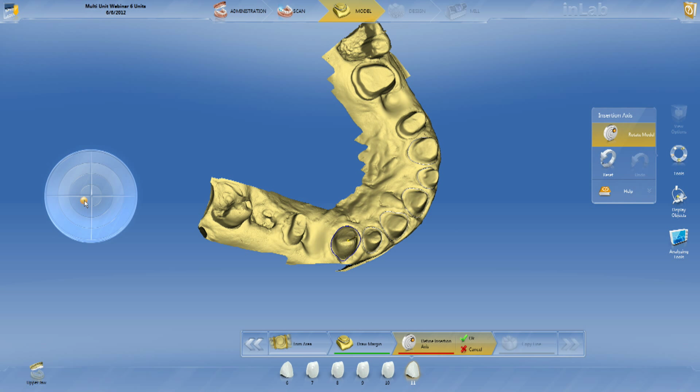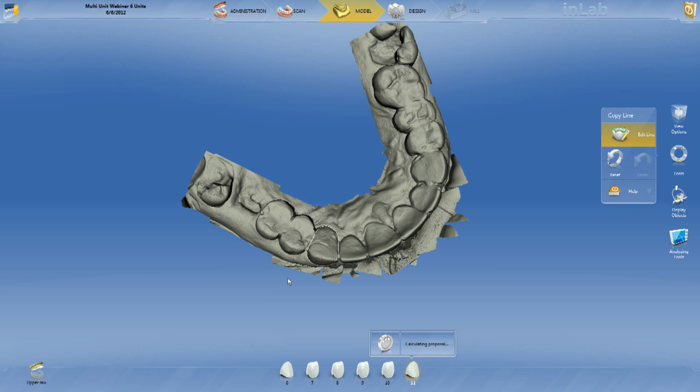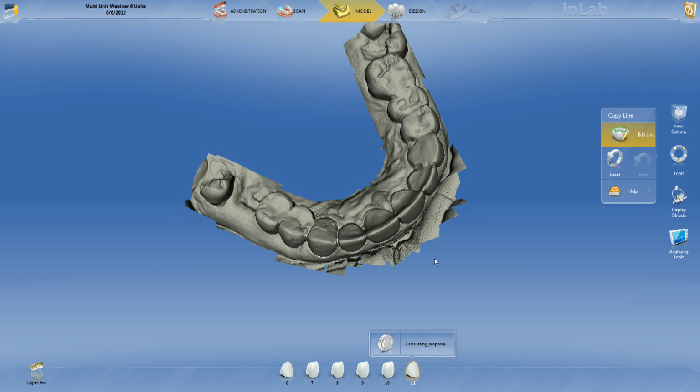You can spend a whole hour on everything that we can do when it comes to a case this big. I mean, if we were doing the whole entire arch, or an upper and a lower. So maybe if I get the opportunity to do another one of these, maybe I'll just spend some time on a full arch upper and full arch lower.